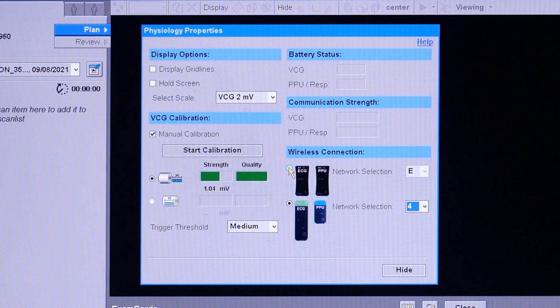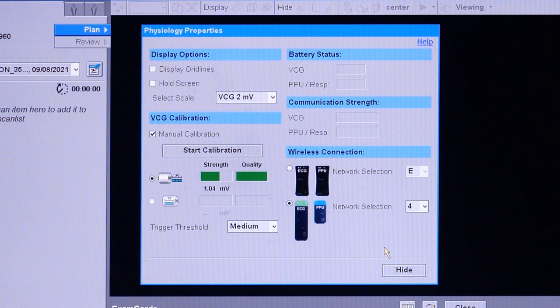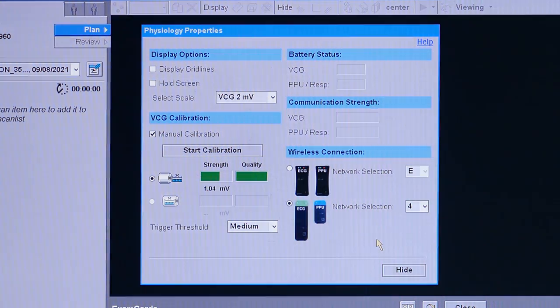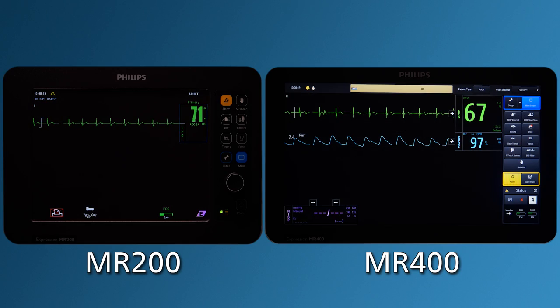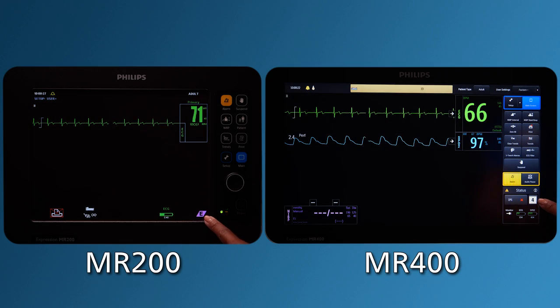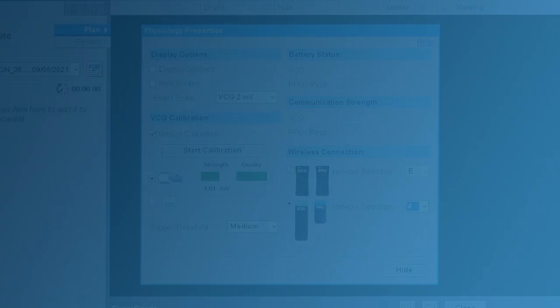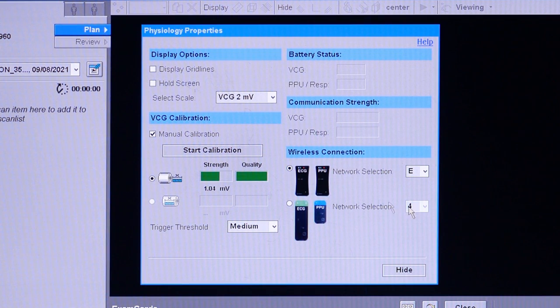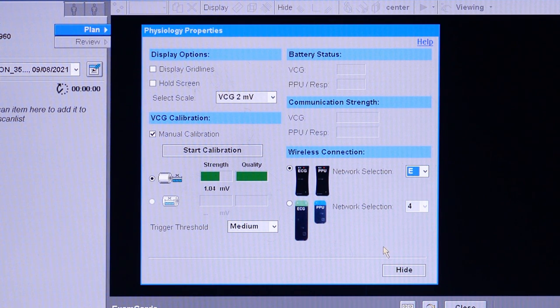Select the top set of black modules when using the MR200 and the bottom set of green-blue modules for the MR400. Then select the network that the monitor and wireless modules are set to. To have a properly working system, the wireless modules and MRI scanner system must be set to the same network channel.